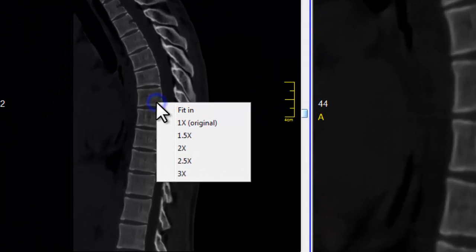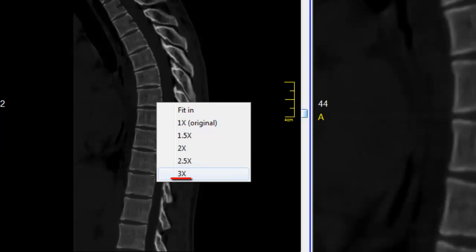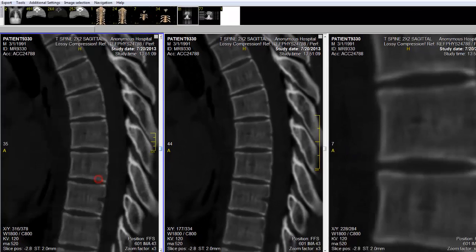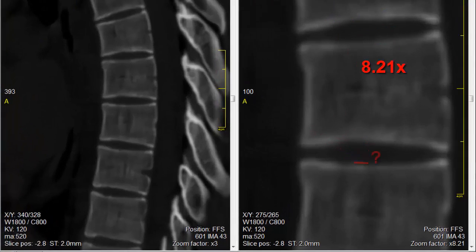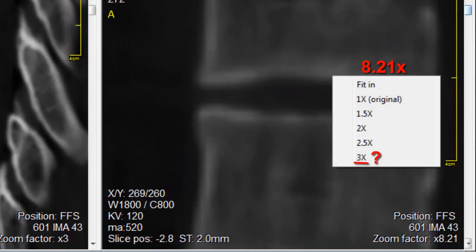Then I'll right click to select the magnification. In this case I'll select 3x. When I hit 3x you notice that the image gets much larger. Now you notice that on the right panel the zoom factor is 8.21.